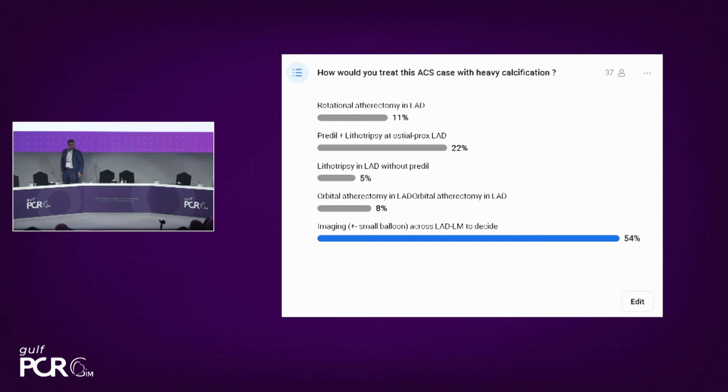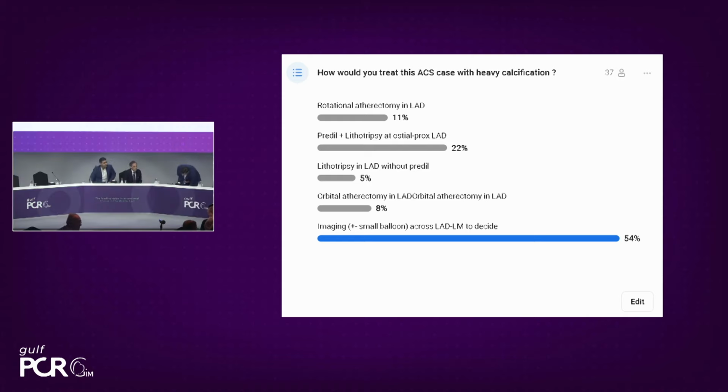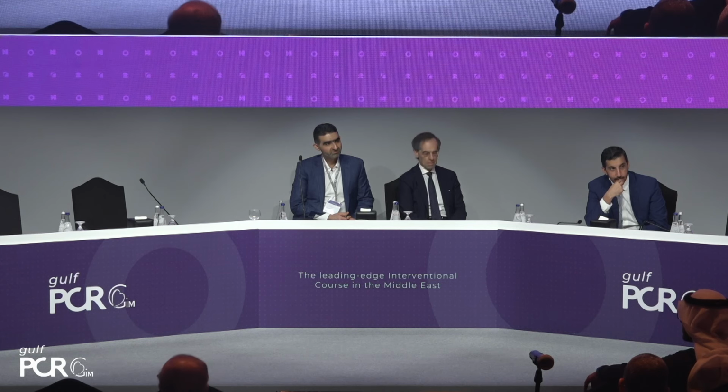So if that was the case, and you've seen how much I have modified, but still that nodular calcification is there, what would you do? Yeah, this is exactly the point where I would modify more before I put my stent, because as you see, after deploying the stent, it's under-expanded in this particular area of the nodular calcium. So I might upgrade to a larger burr size or ablation, or use orbital atherectomy to shave the calcific nodule more and have more predictable expansion of the stent at this particular site.